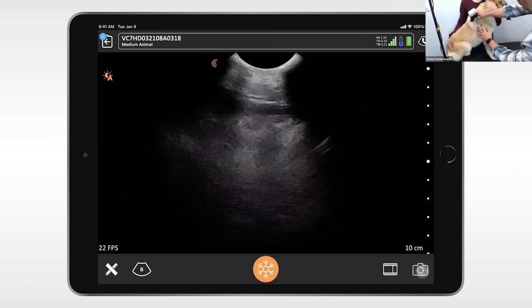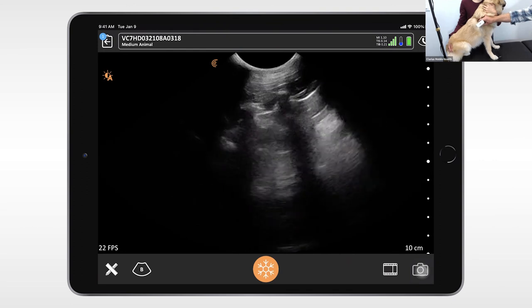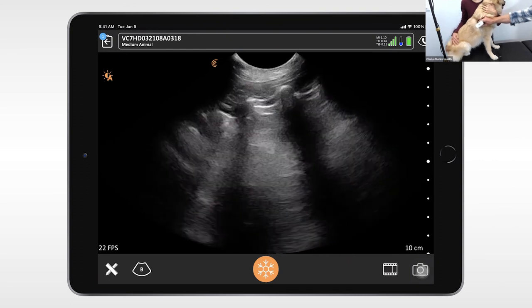And then finding the ventral boundaries, and finding the boundary and then doing the Z scan all the way down, right? Absolutely, to the most dependent zone. So essentially you've gone to the caudal dorsal area where you can look for things like pneumothorax in a standing patient, and then you're scanning multiple lung surface regions. Great job picking up the bat sign and the lung there. Excellent. Perfect. That's exactly it.